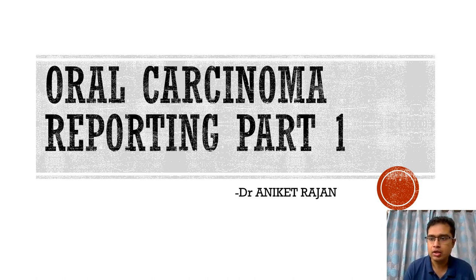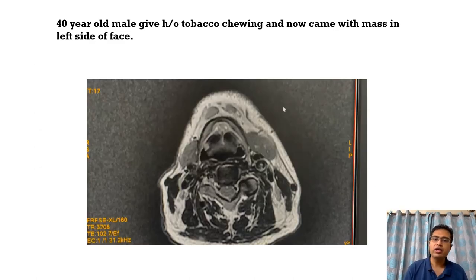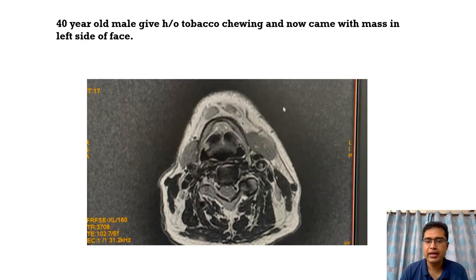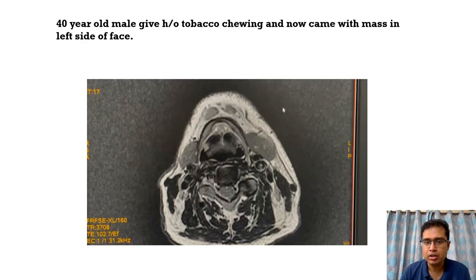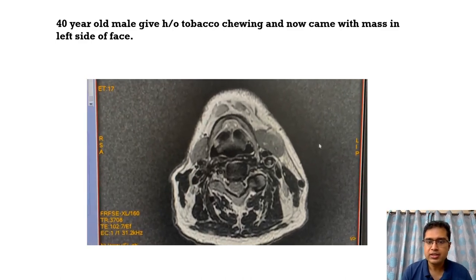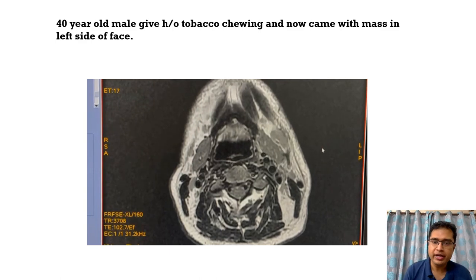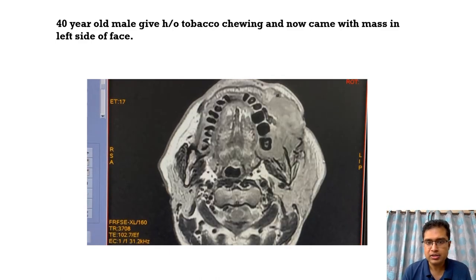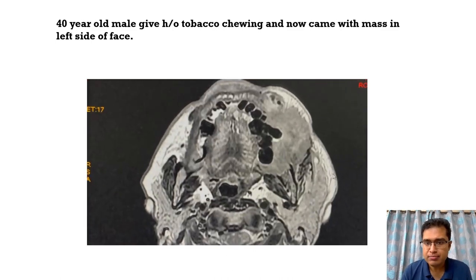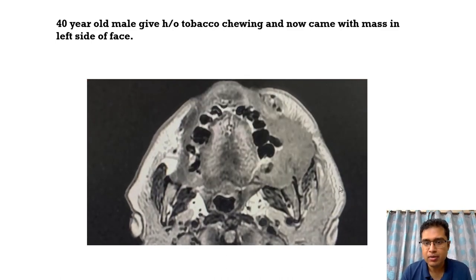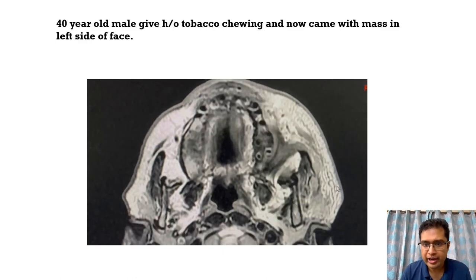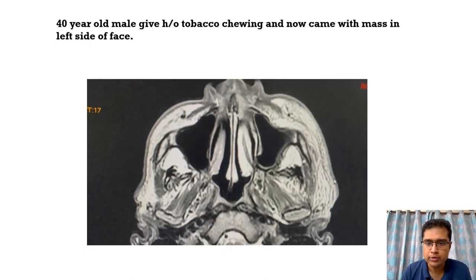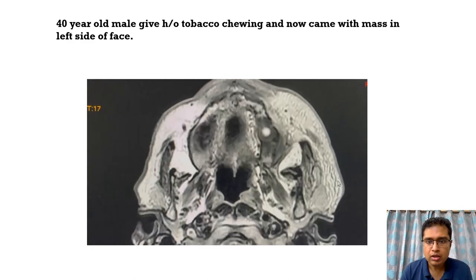Starting with our case today: a 40-year-old male who came with a large mass in the left side of the face with a history of chewing tobacco. This is the MRI done for this patient — axial T2-weighted images scrolling from cranial to caudal direction. This is the maxilla, these are the muscles of the tongue, and here we can see a T2 hyperintense mass epicentered at the retromolar trigone and the posterior alveolar ridge.